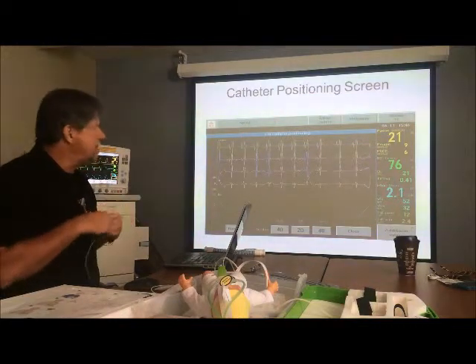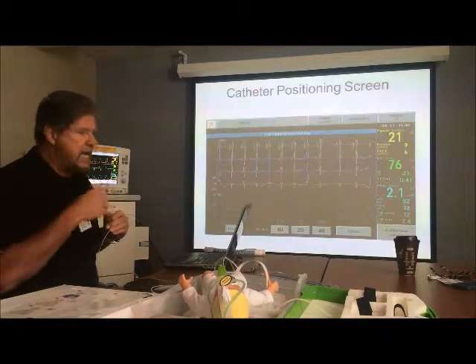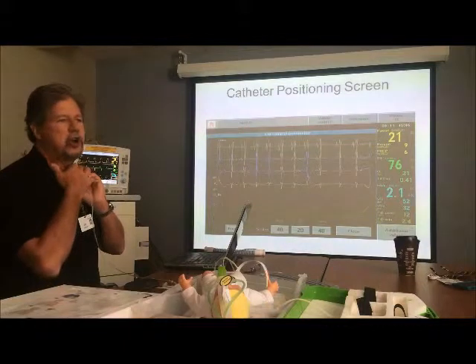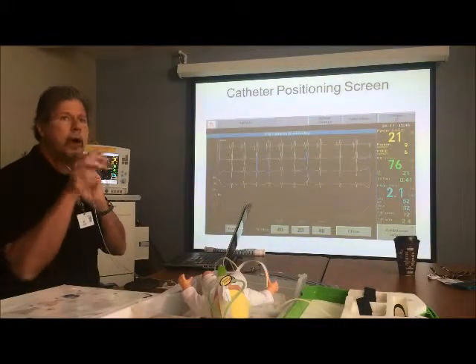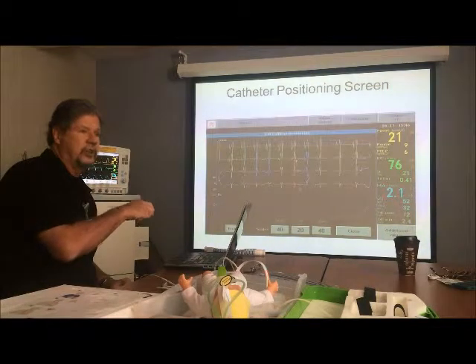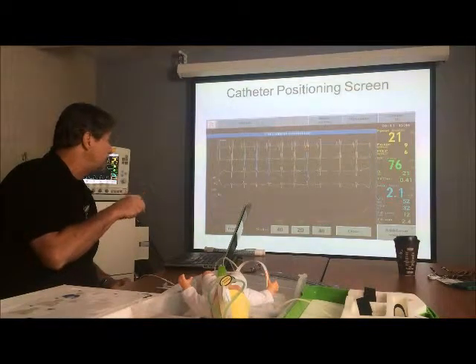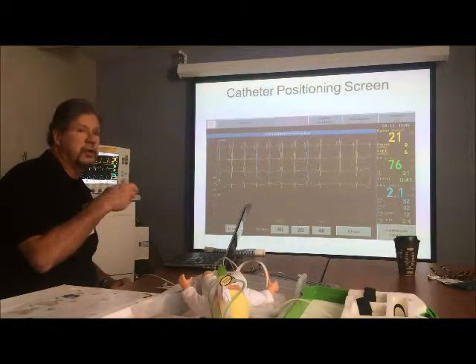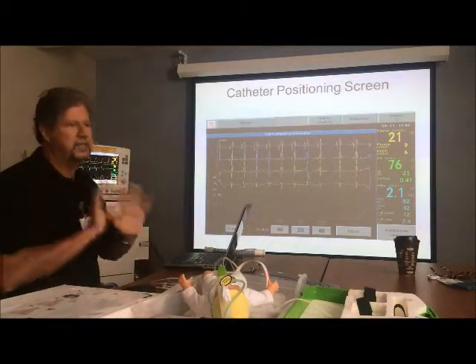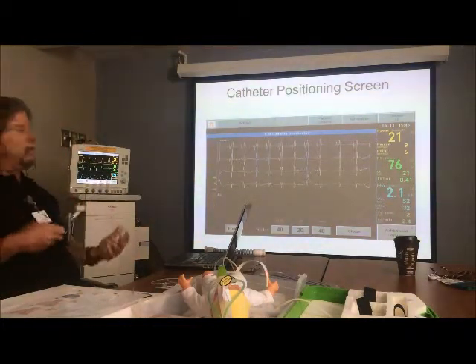The reason is that sometimes the blue, which is the EMG of the diaphragm, EDI, can still appear even though it's like this, because you get some noise occurring from the musculature. You see, oh, I see blue, but yet all the QRS looks all the same. And you go, wait a minute, you see blue, and in those cases, sometimes you see blue jump from here down to here, then back up to here, and so on and so forth. And you say, something isn't right, and the reason is because the QRS is not right. We need to get the QRS right. And once that's done, it tells us that we're in the ballpark.